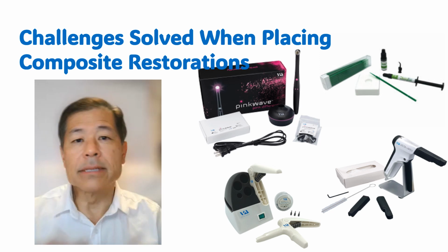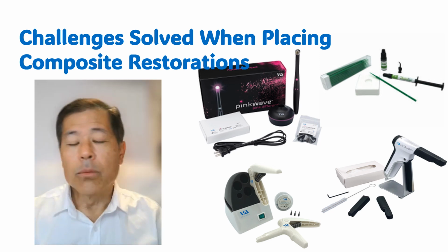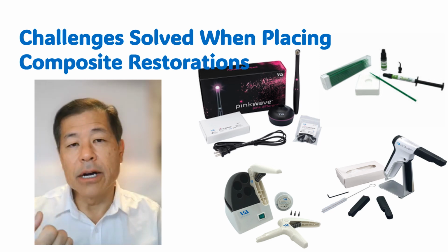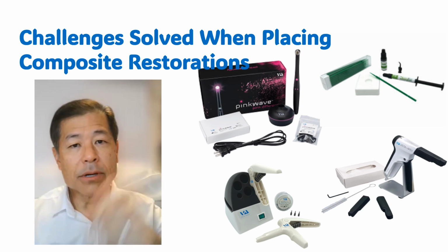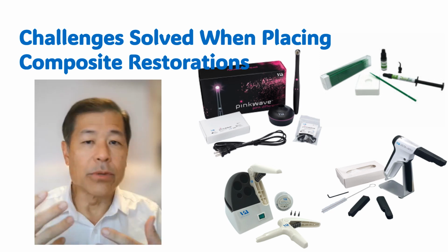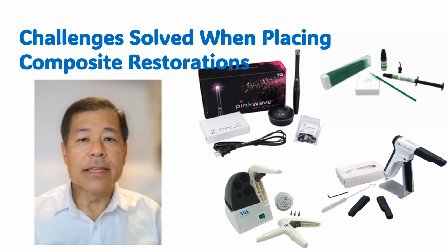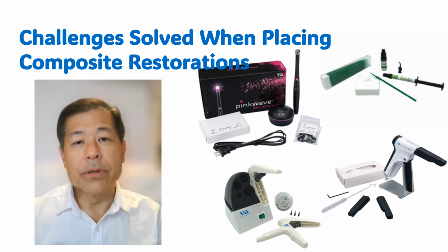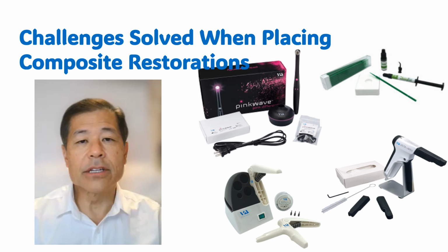Now, most of the composites that I do, I usually don't use more than one compule. And if I do, I can sense that I'm getting towards the end of the compule by how far I can squeeze the composite gun. And as I'm smoothing that part of the composite out, my assistant can put another compule in there, activate the gun, and again, within 45 seconds, it's going to be warmed up and ready to go. So the fact that it is a compule type composite gun that we're doing all the heating in isn't a disadvantage. It just makes life pretty easy.